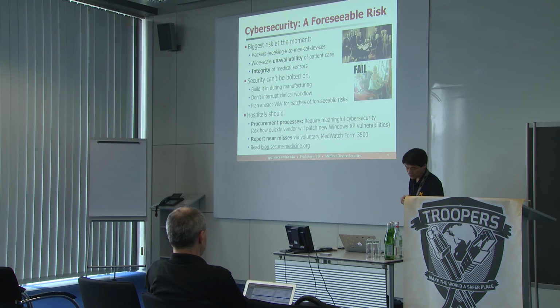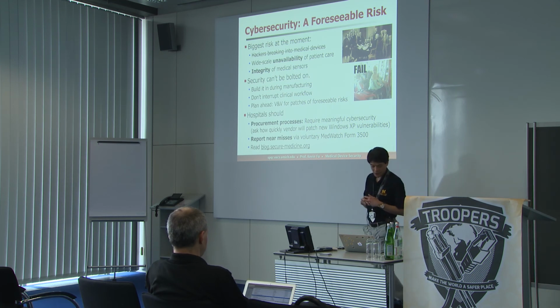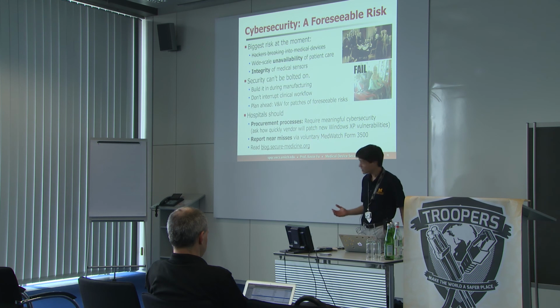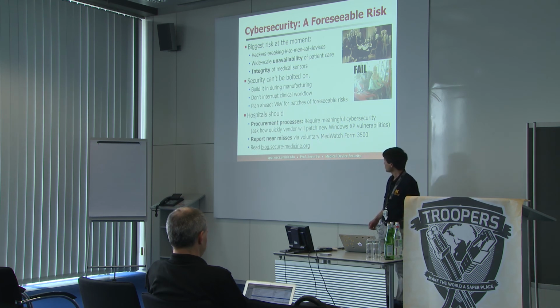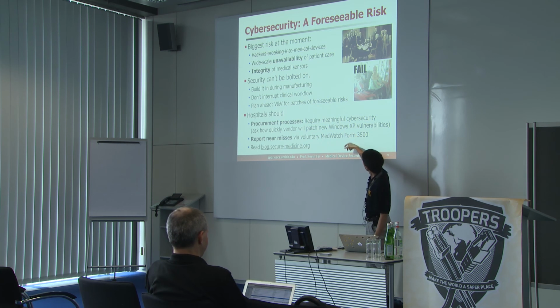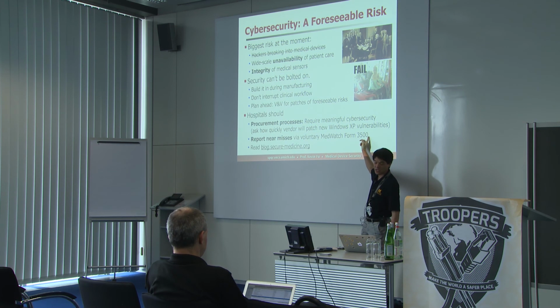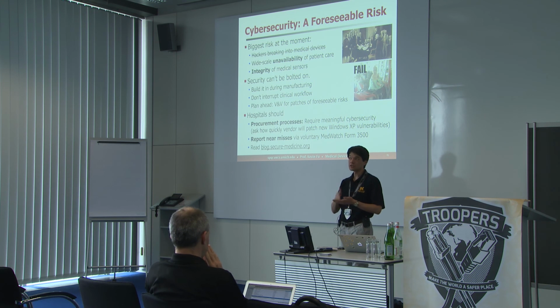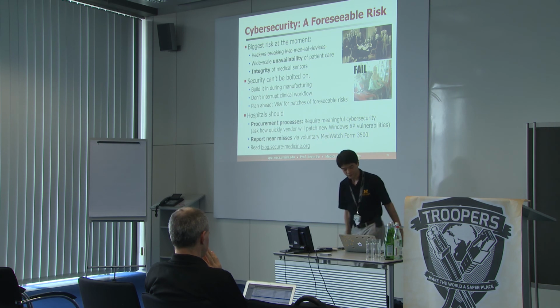And if you do find a problem in a medical device involving security, there are a lot of different ways you could try to report it. You could try contacting the manufacturer. That's usually hard because they usually aren't set up to receive such data. You could use what's called the MedWatch Form 3500. This bureaucratic speak is a document that the FDA uses to collect data on injuries and deaths related to medical devices, but you can also use it for things where you don't know of a death.